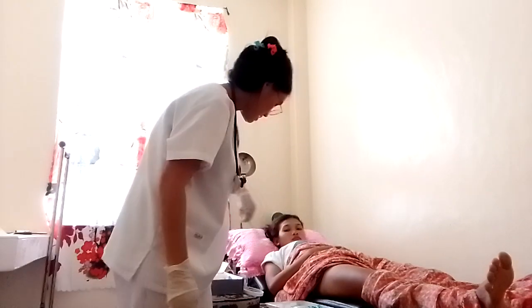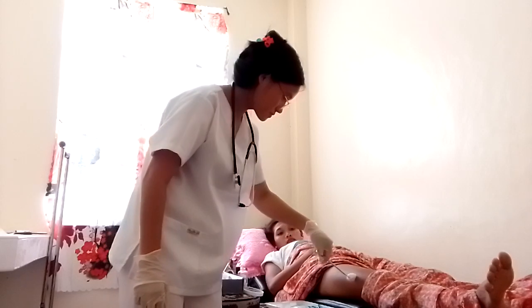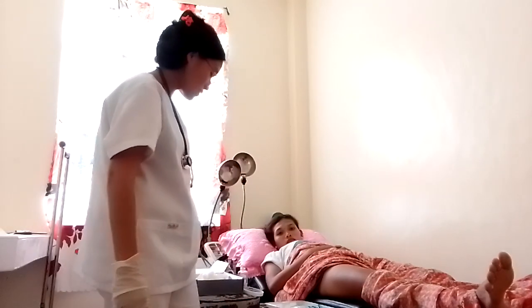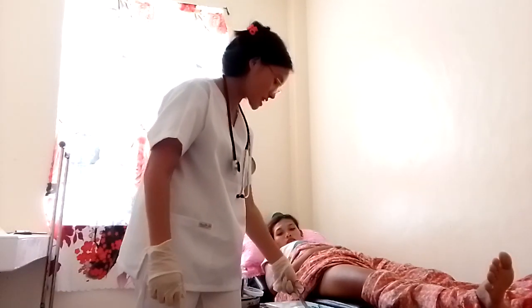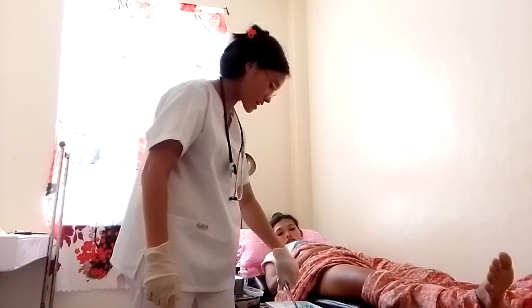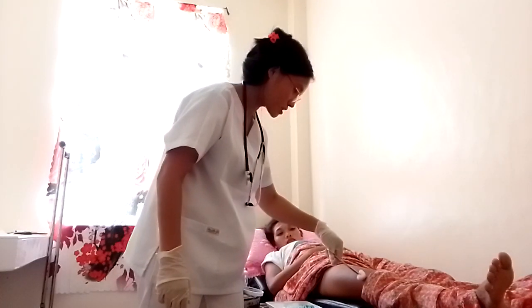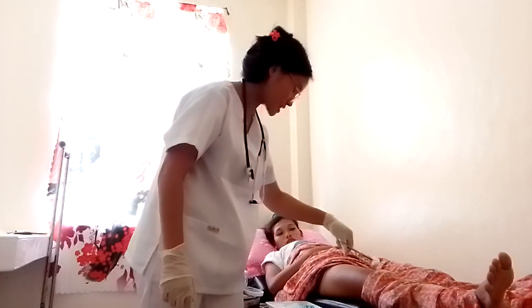Okay. Okay, so magkuha na sa lubusa. Nag-working forceps na ko kay dili ko ganahan mo touch sa samad sa atong pasyente kay basig na ay bacteria or na makuan siya sa organisms or microorganisms nga nanapod sa ako nga kamot. So nagamit lang ko og working forceps.